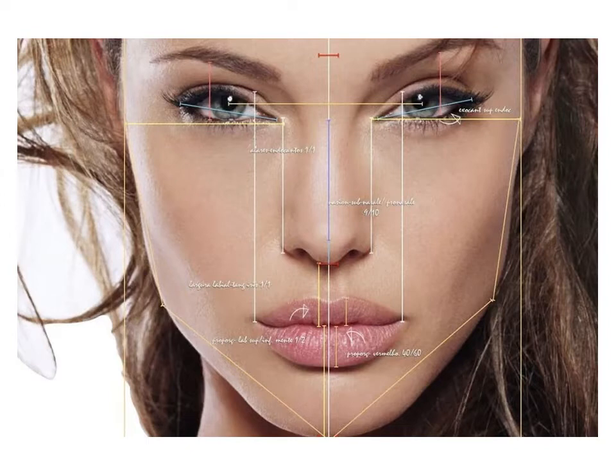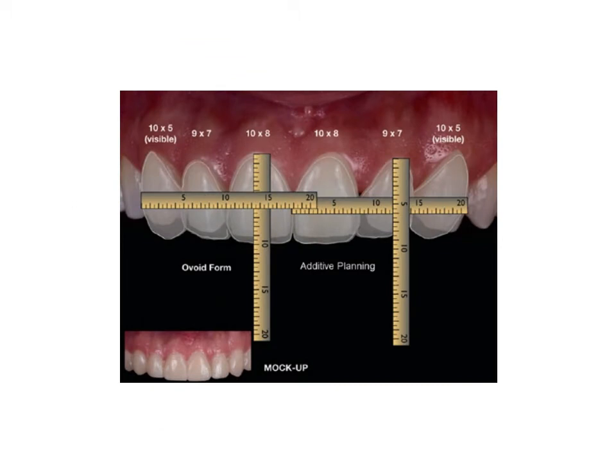Teeth taken from a virtual library including various morphologies, such as triangular, square, and ovoid, are adapted to the digital design, and after calibration with the digital ruler, the new dimensions and proportions of the restorations are determined. This includes the dental axis, its relation to the smile line, gingival margin, face midline, height of the interdental papilla, and incisal embrasures.